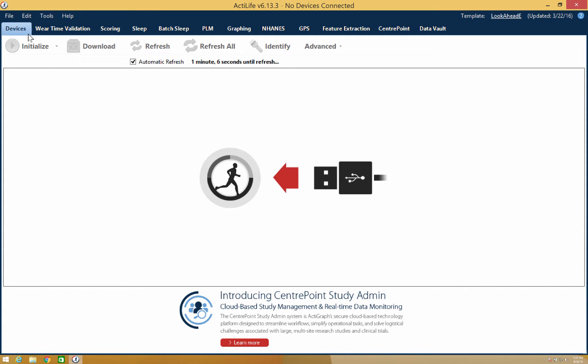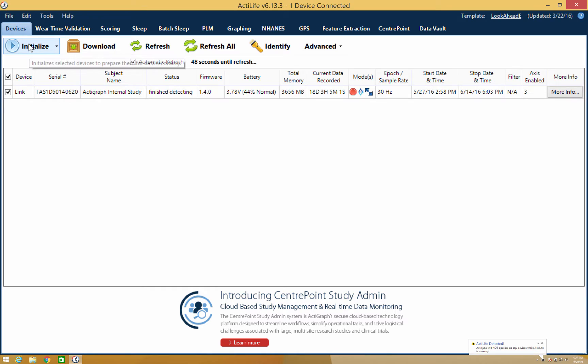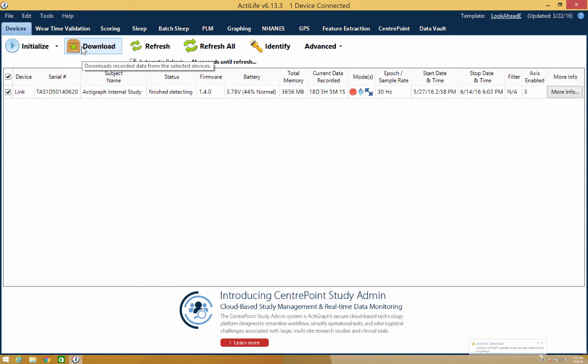We'll start by plugging a device in. From this tab, you'll be able to manage your devices and view information about the specific device, such as the serial number, the current firmware, the battery life, and so forth. You will also be able to perform actions such as initialize a device, download data, or update the device's firmware.